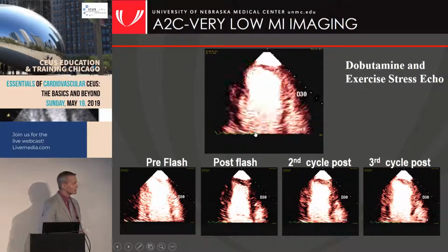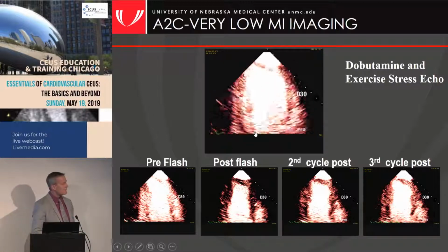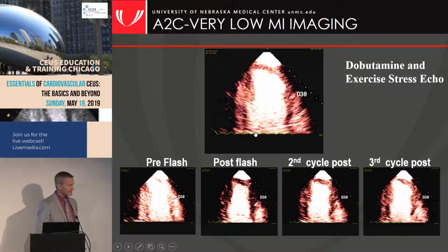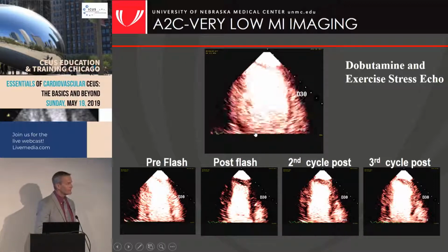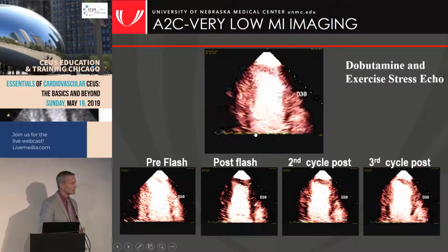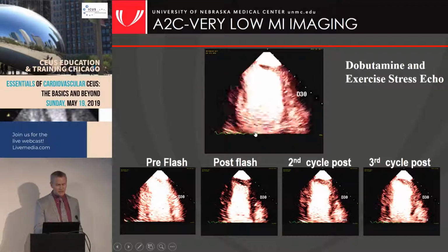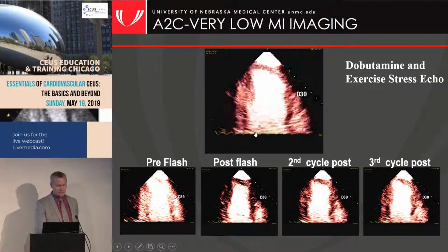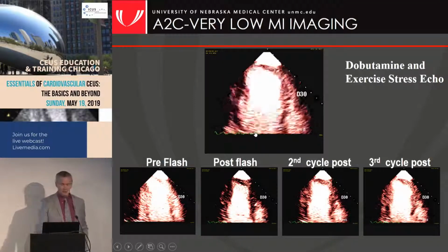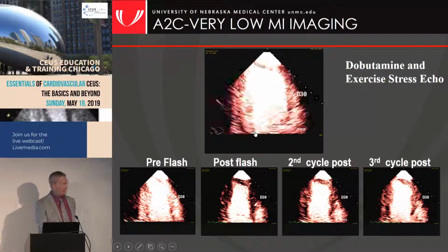That allows us to see the regional wall motion after that high MI impulse. Just one question too. Did you start with dobutamine when you're ramping up perfusion and then move to treadmill? Yes. That's exactly the sequence. Because there were some questions on where do we start? And some do bicycle with it, but treadmill's the universal one that we use. It's a little tougher, but if you're using this technique in a real-time fashion like this, the sonographers get very good at it, because they're used to already doing this rapid acquisition, within a minute. They're just adding now some high MI impulses.